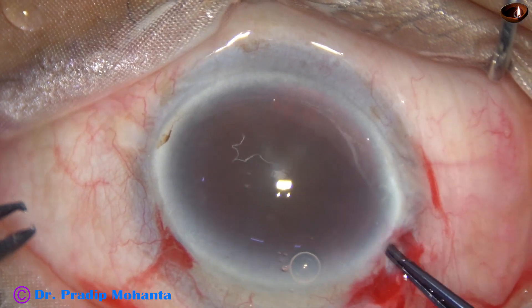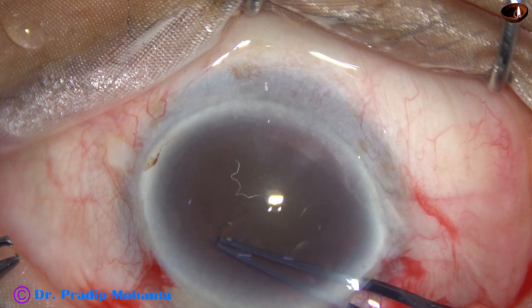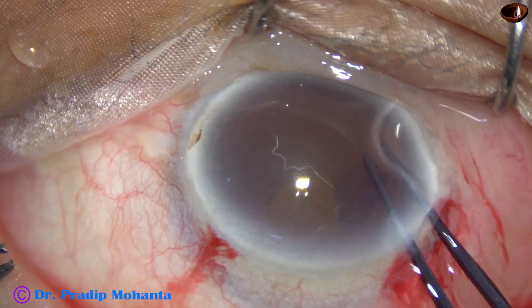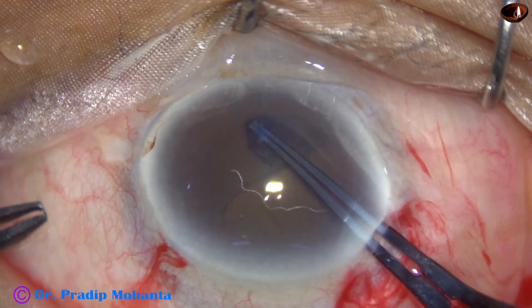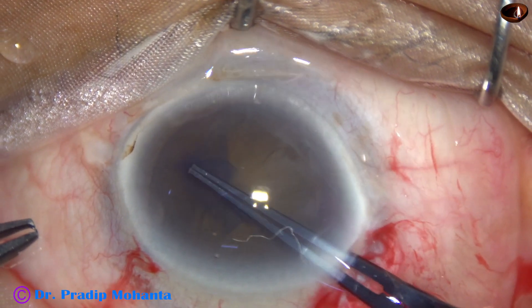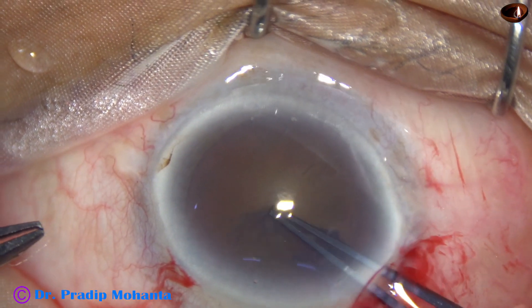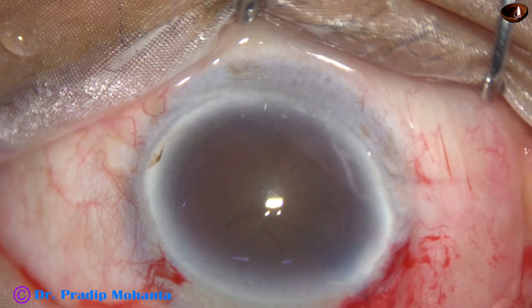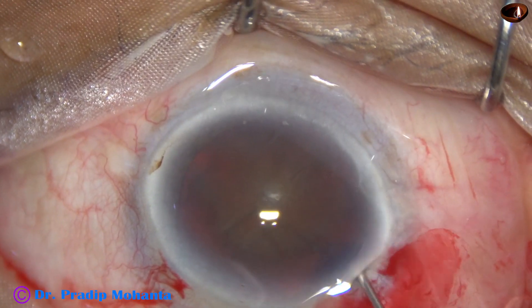And now capsulorhexis. This is a very hard cataract — nucleus sclerosis is about grade 6. A large rhexis is done in such cases, as a small rhexis causes a lot of problems during management of the nucleus.